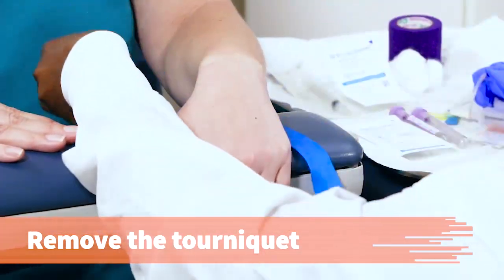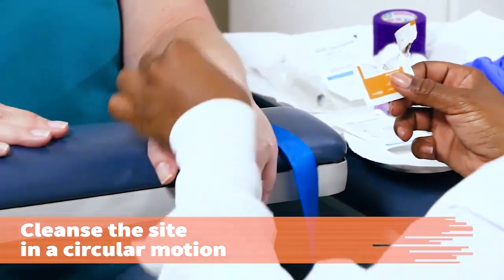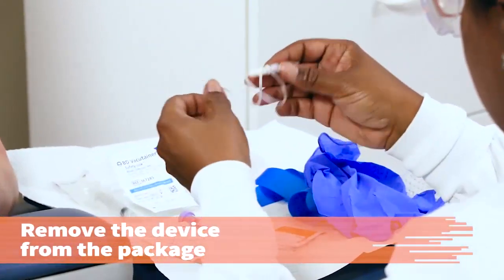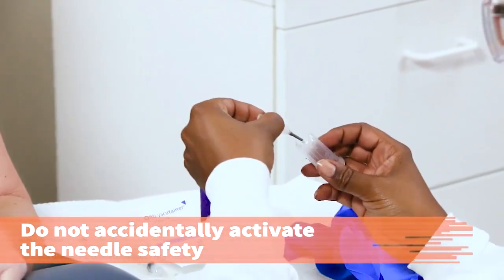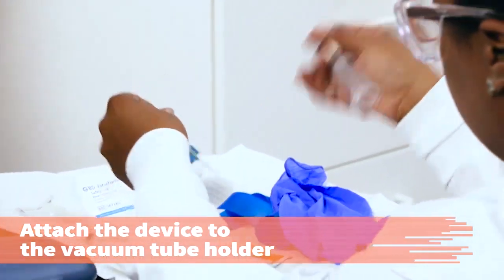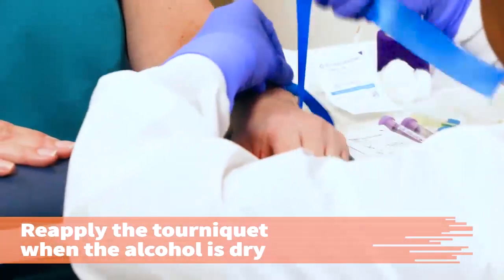Remove the tourniquet and cleanse the site, starting in the center of the area and working outward in a circular pattern with the alcohol pad. Assemble your equipment and supplies on the non-dominant side of the patient's arm. Remove the butterfly device from the package and stretch the tubing slightly. Take care not to activate the needle retracting safety device accidentally. Attach the butterfly device firmly to the vacuum tube holder using the sheathed needle at the end of the tubing. Put on disposable gloves.